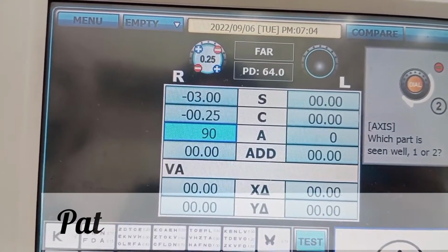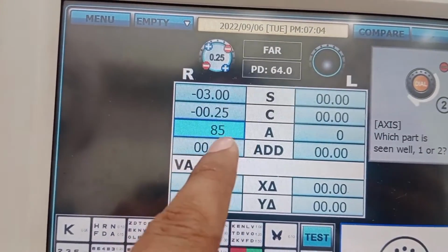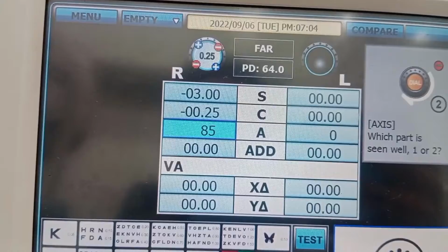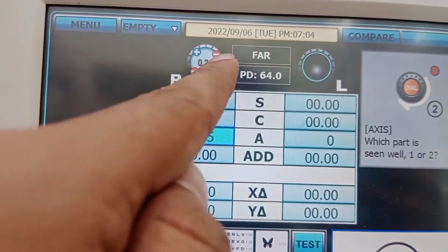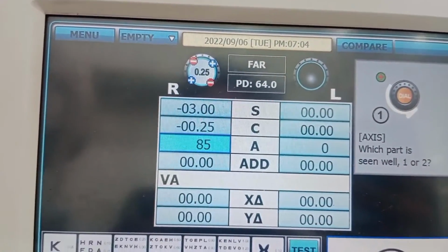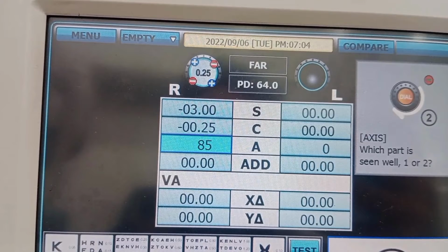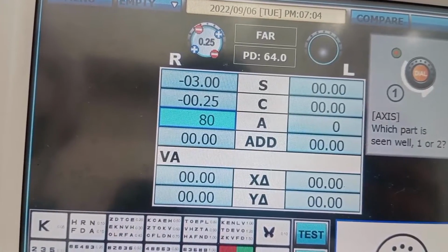and suppose the patient chooses 45 degree with minus cylinder, and the trial cylinder axis is 90, and we will move 5 degree towards the 45, which is 85, right? So our new axis is 85. And now this is position number 1 again, this is position number 2, and suppose the patient preferred minus cylinder again in the 45 direction, right? So we will move 5 degree towards 45. Now our new axis is 80 degree, as you can see, right?